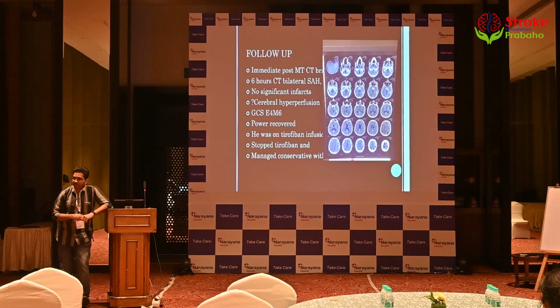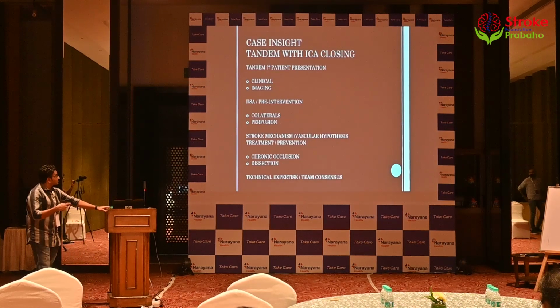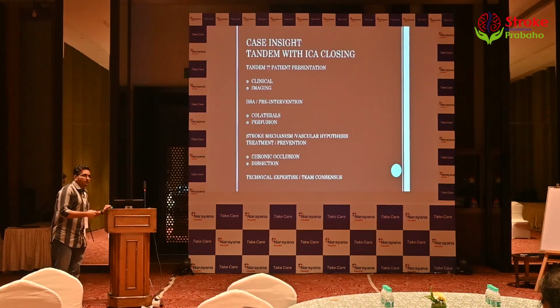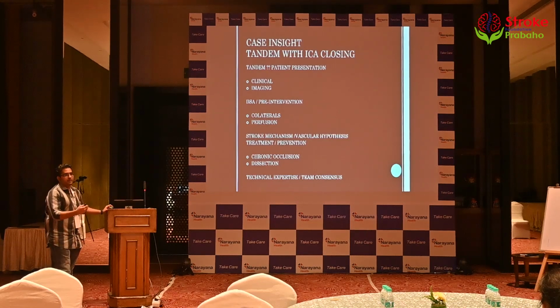Okay. So there comes the question of the first part, whether he had actually an infarct or not. A progressive infarct. Right. Agreed. So anyway, this is last week's patient, so I'll ask him how they do, but I'll finish with this slide. At the end of the day, I think the definition of tandem is what we give tandem as. We shouldn't be very dogmatic about tandems. I believe every atherothrombotic stroke is tandem. A clot below, a clot above. It's a question of what we do next.